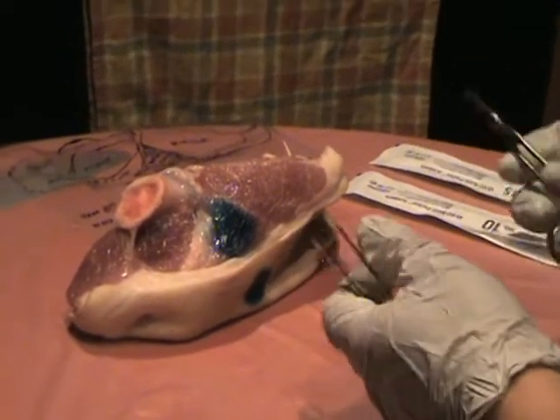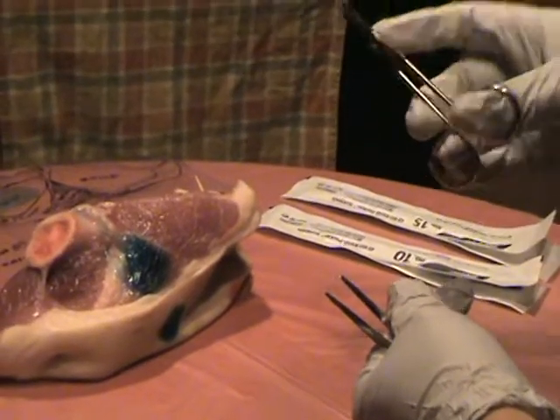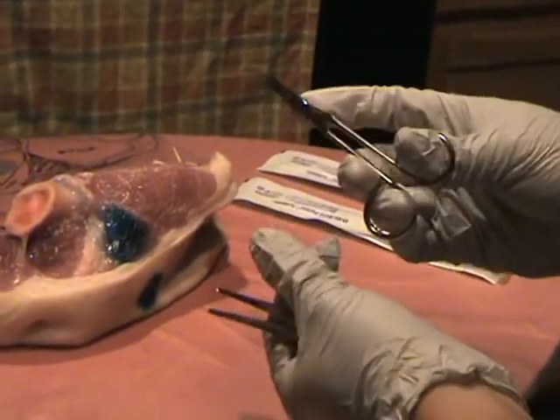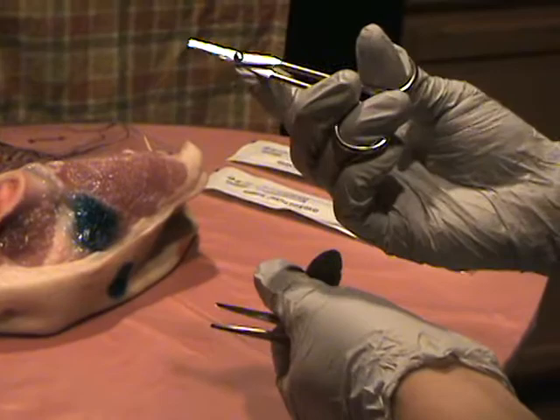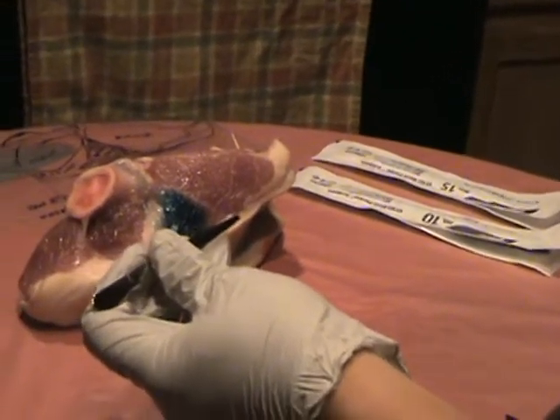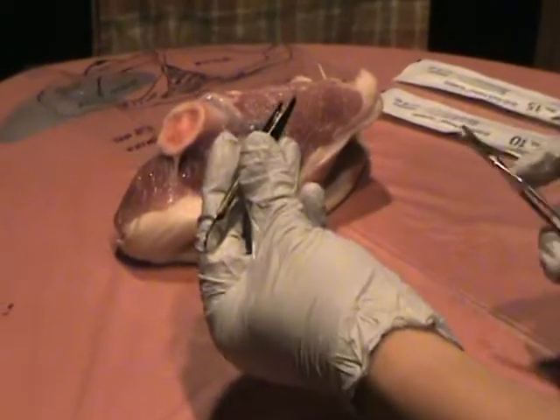So for the sharp debridement, my dominant hand again is the right, wherein I'm going to be using the 3-point procedure here. My ring finger will be on this side, thumb, and then middle finger supporting over here, and then my index finger will be on top, close to the tip of the scissor or the joining. My forceps will be resting on the 3rd and 4th fingers and the thumb. Okay, so we'll be starting now.